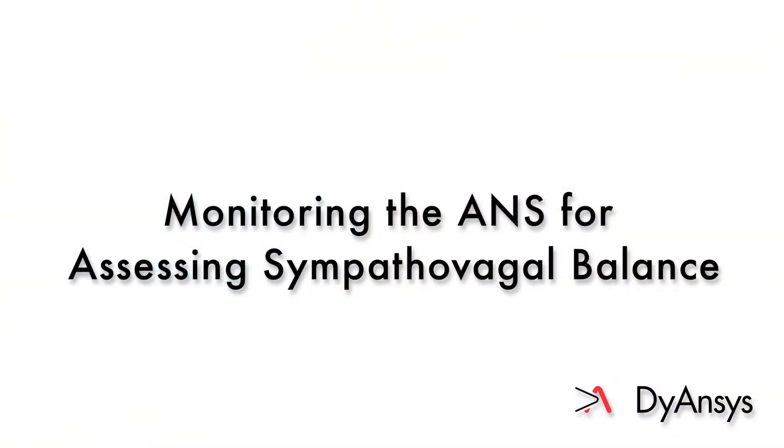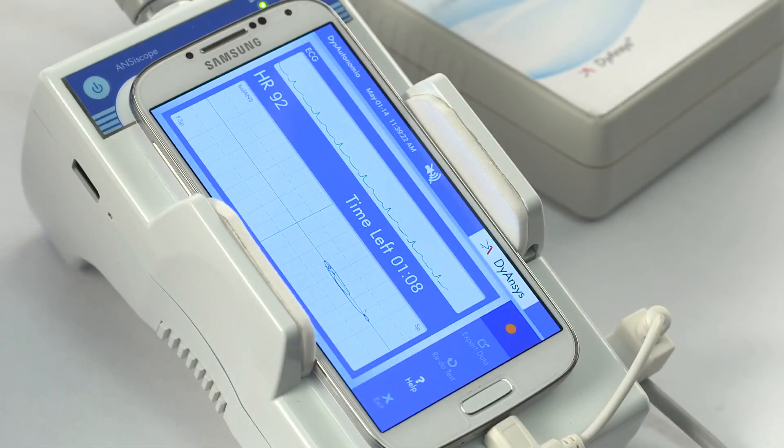Monitoring the ANS for assessing sympathovagal balance. This measurement is used to monitor the progress of the treatment and also to optimize ANSYSTEM needle placement. The leads are kept on during the entire ANSYSTEM procedure, which takes approximately 10 minutes.